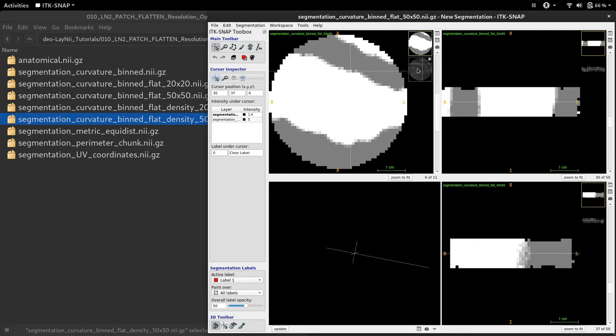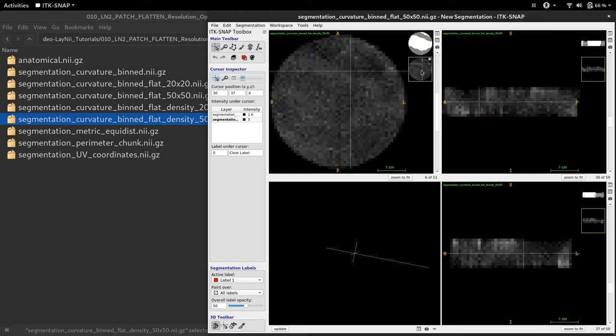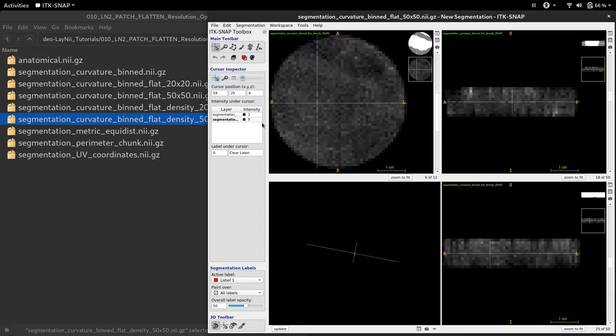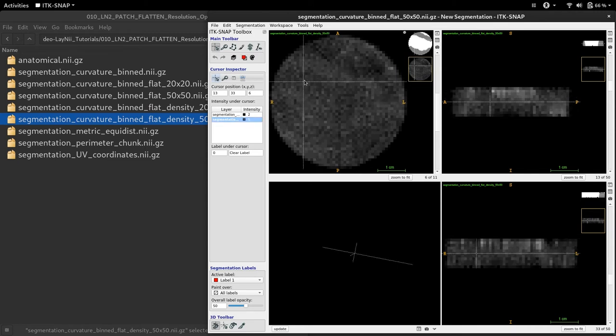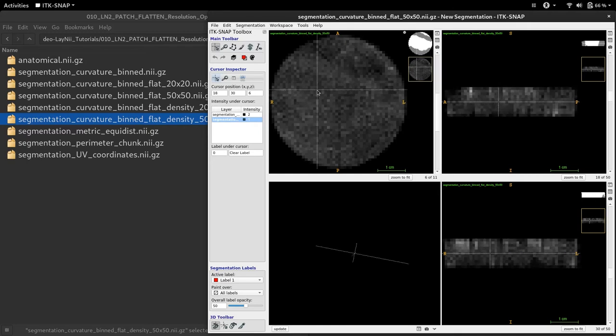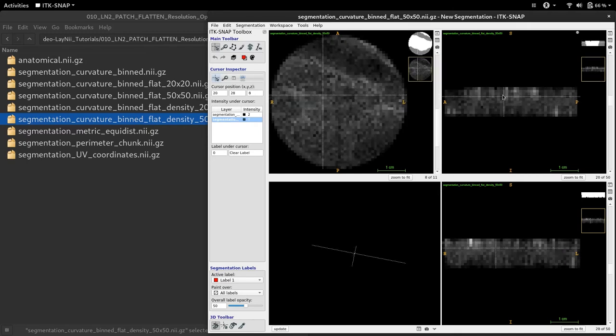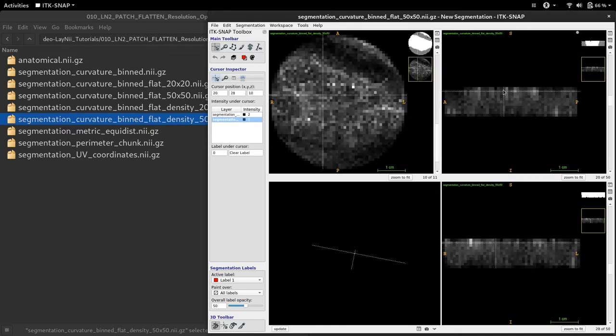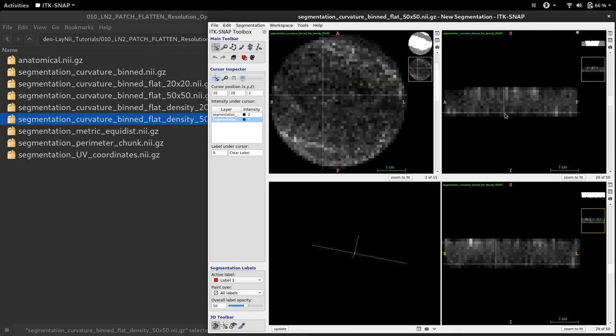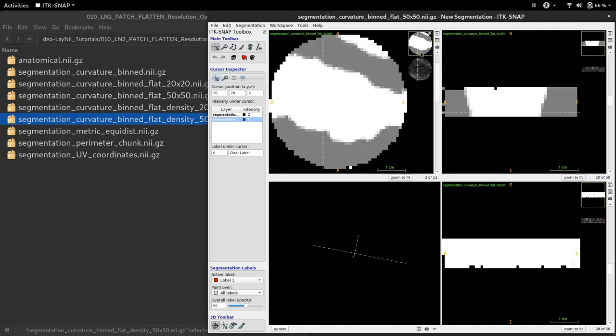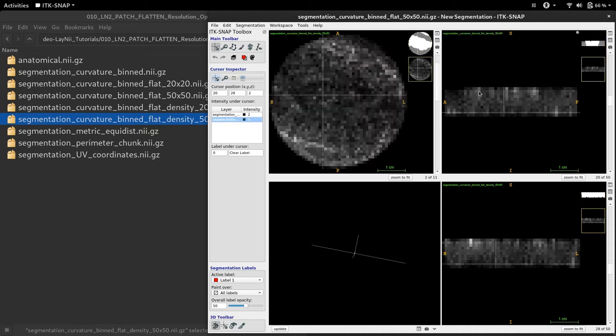Let's have a look at the density file. Here you can see that the densities overall have decreased from around 30s plus minus 15 to 10s in the middle gray matter. Of course, when you go to superficial or deep gray matter, the local densities of how many folded brain voxels fall into the same flat brain bin or voxel will change depending on the curvature. This is expected.